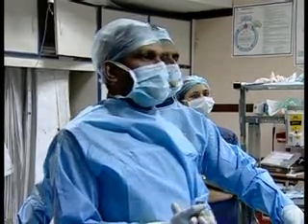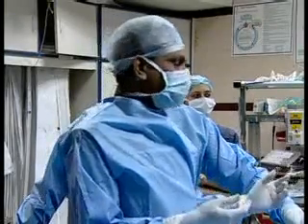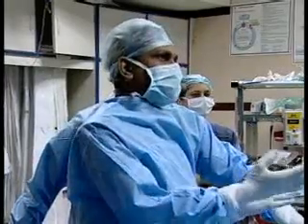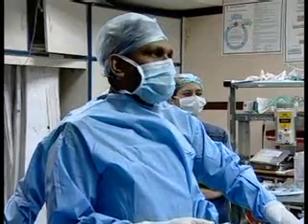We have done it in the LAO 45 and 20 cranial, because LAO 60 is going to give a little bit of a problem to the working area. So I have to reduce a little bit of LAO and then use the cranial. You can see the VSD, which is a little bit away from the aortic valve there. The angiogram is done with 25 ml at 12 flow, 700 psi. Probably we need to give a little bit of high pressure to profile much more.